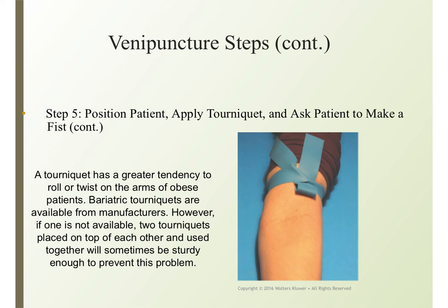But that does not mean that you need to rush and take it off. There are some that say pop the tourniquet as soon as you see blood. I'm telling you, you do that, you might have to redraw the patient depending on how many tubes you get, okay? I do not suggest that. And we're going to practice in the lab just how long 1 minute is, okay?